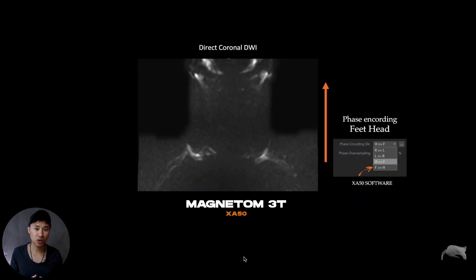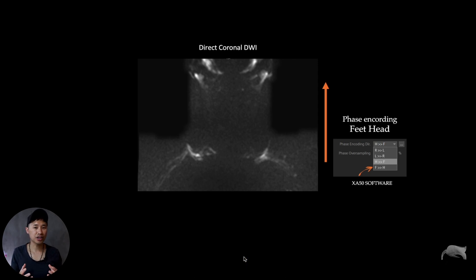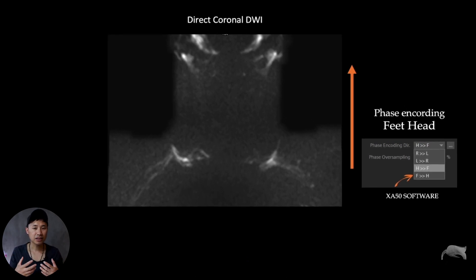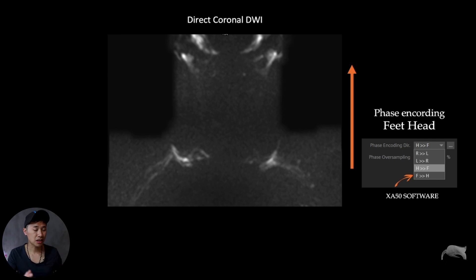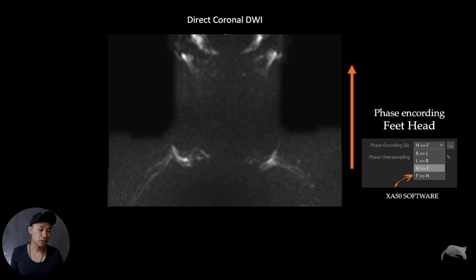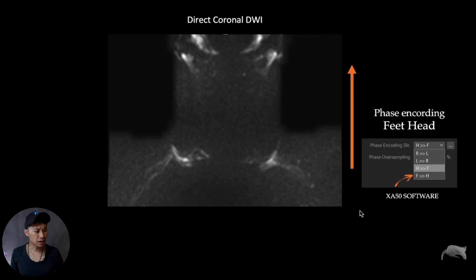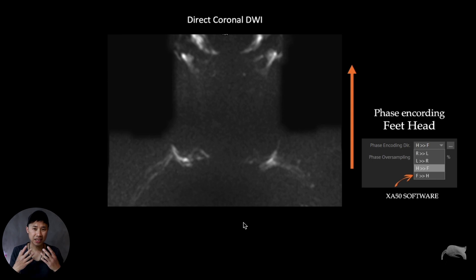We're currently at 3T, but this can be done on 1.5T as well. On 3T it can be more difficult — more challenges — because diffusion at the head-neck area, soft tissue and air distortion kicks in much more on 3T. However, I will show you simple tricks which means you can be doing this on 3T as well. We are on XA software 50, and you have many more options compared to the older systems.